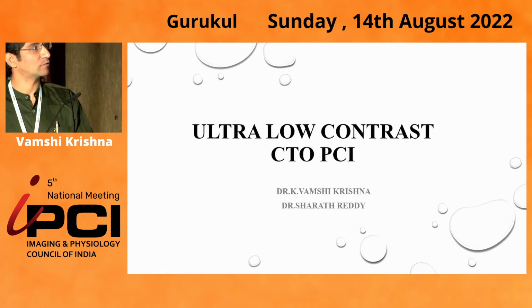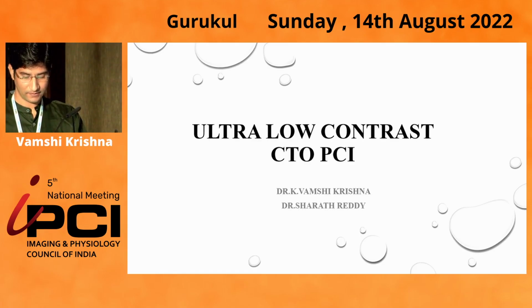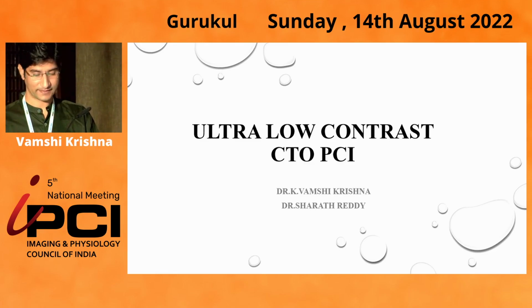Today I am going to present a case on ultra low contrast CTO PCI. This has been done with my mentor Dr. Sharath Reddy.